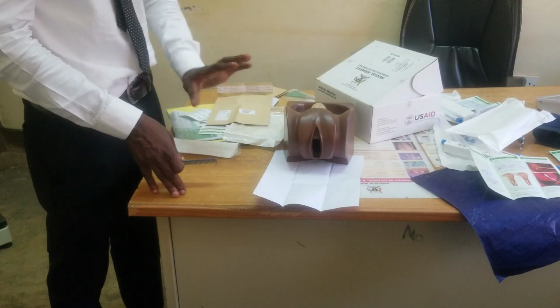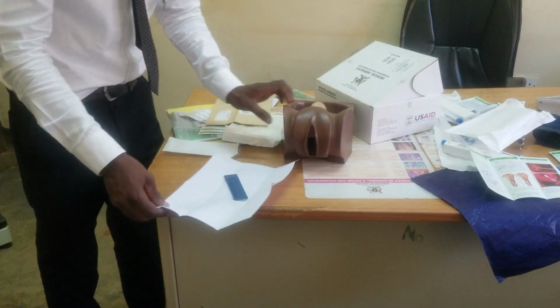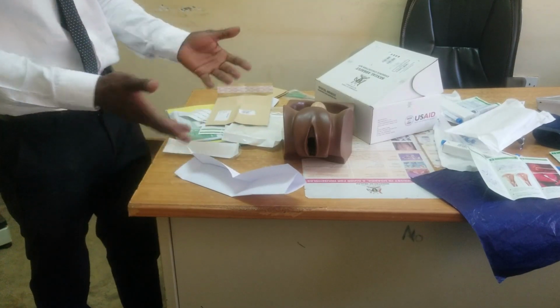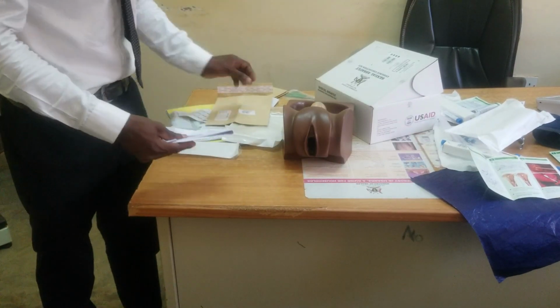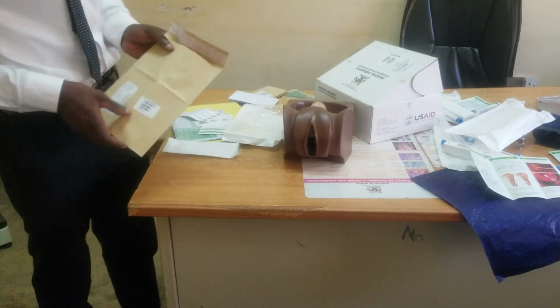Even if you see nothing, you still have to close. You place it, then pack it in an envelope, label it, and seal.